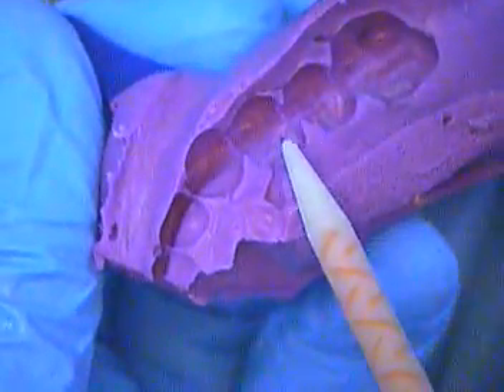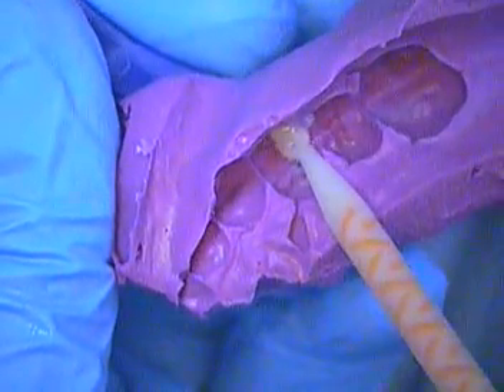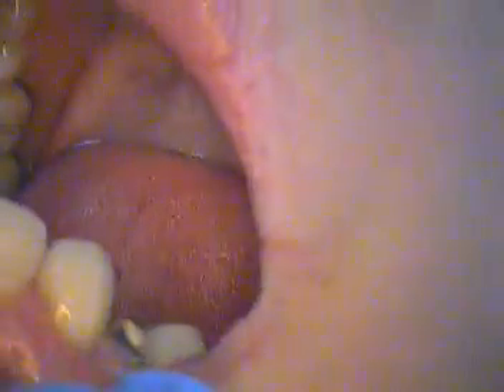We're back. We're going to make a temporary using the initial alginate impression we took. Everything is out — all the cotton rolls should be out. Inject with the tip all the way in, take it to the mouth, hold that, open nice and wide. Put this in place, find a happy ground for it, close all the way down nice and easy, squeeze and hold. We're going to wait about 50 seconds.